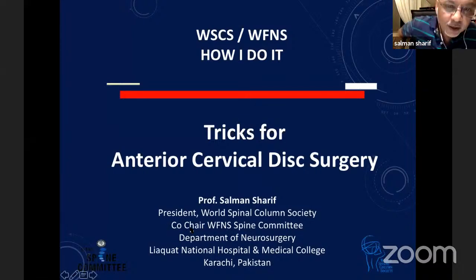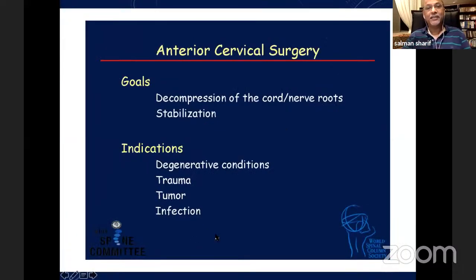So I will be talking about anterior cervical disc surgery. I also want to thank Saud for his ever glamorous introduction, as always. I'm grateful for that. Well, anterior cervical surgery goals are decompression of the cord, nerve root, and stabilization.